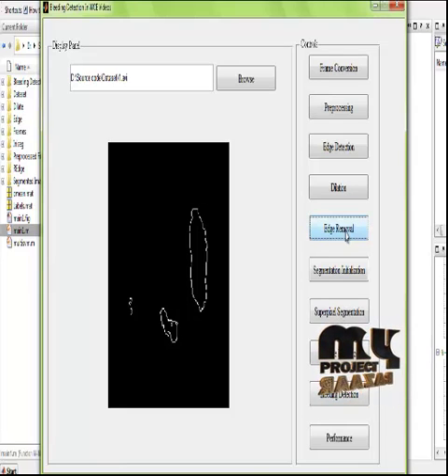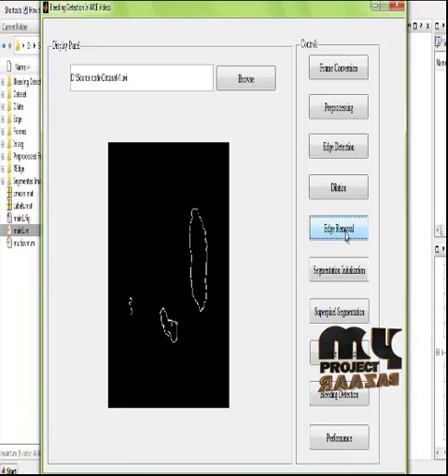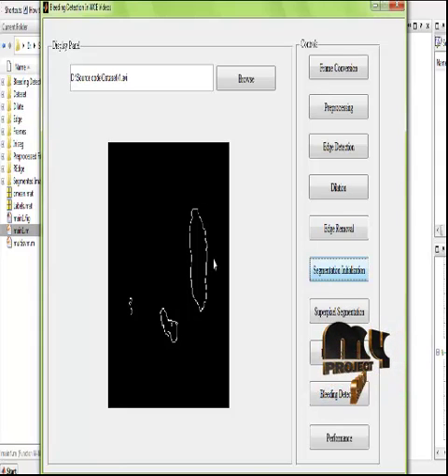This final edge pixel set consists of all the necessary edge regions to be used for the further initialization and the superpixel segmentation processes. The superpixel segmentation initialization is based on comparing these detected edge regions with the original images and placing these edges in the original images.